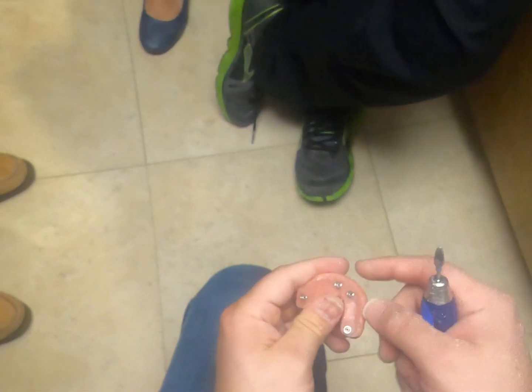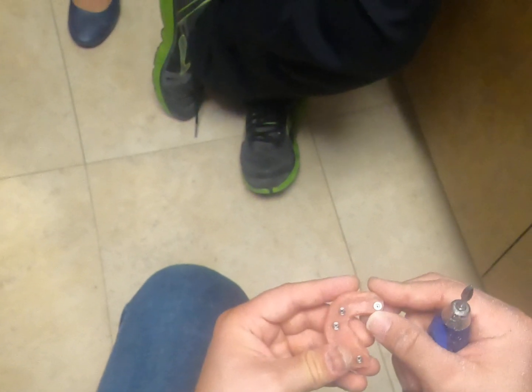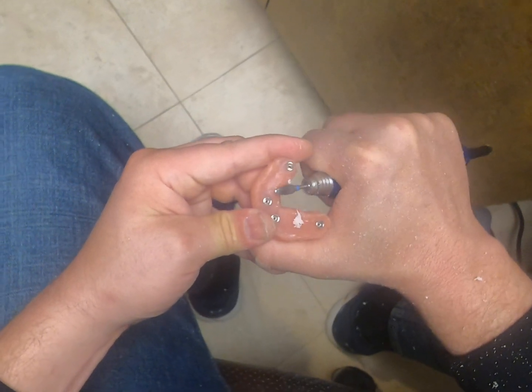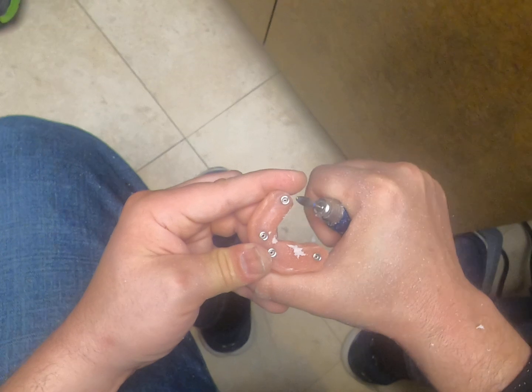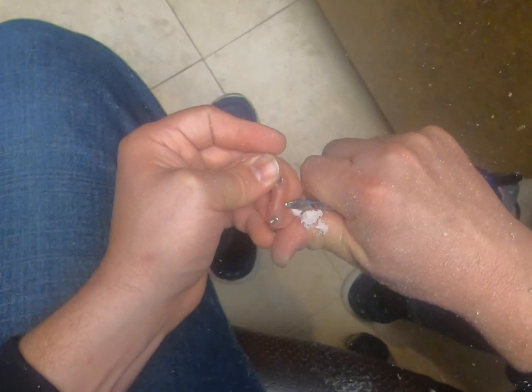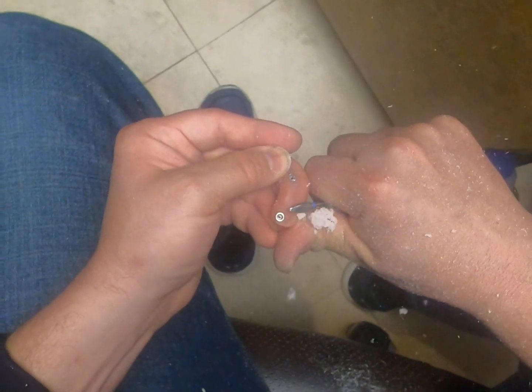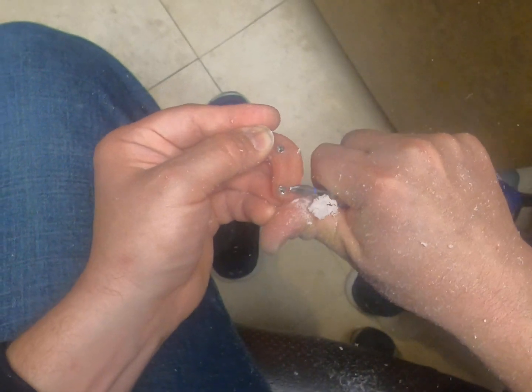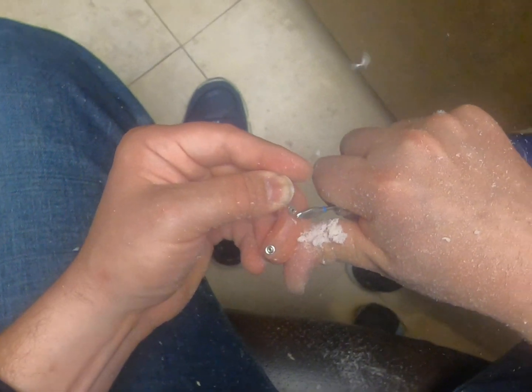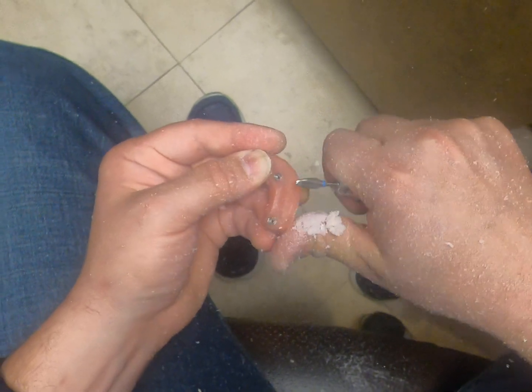So at this point, all you're going to miss out on is me shaping this and then going to the mouth — the intaglio surface, just the tissue surface there. That's all you're missing. Just getting rid of the excess acrylic and creating a hygienic surface there. The plastic is pretty much straight across, right? So if you look at where the tie bases are, the inside kind of looks too much straight across but rounded on the sides. There's so much tissue there, it'll push it down a bit. You don't want food traps — for this process that's what you want.